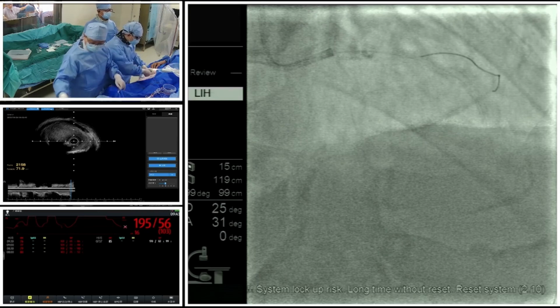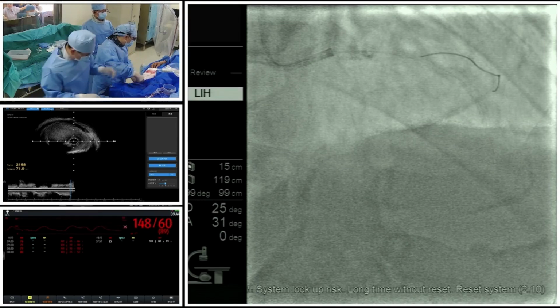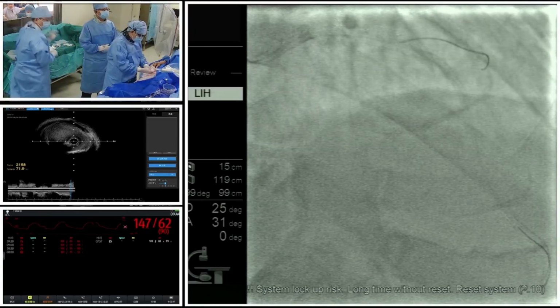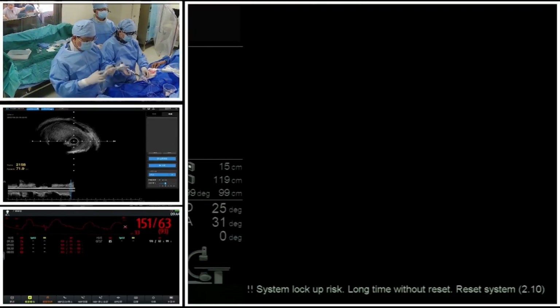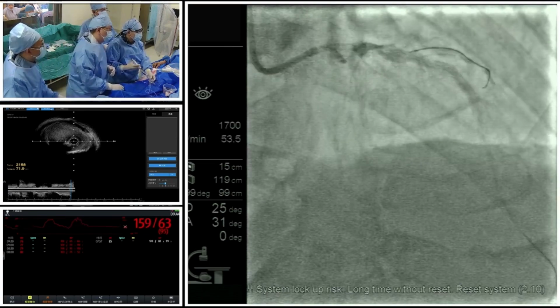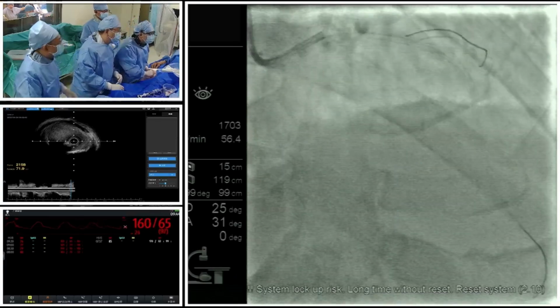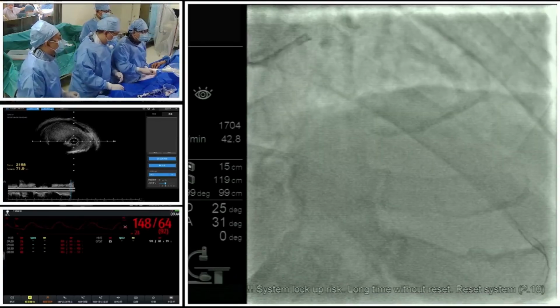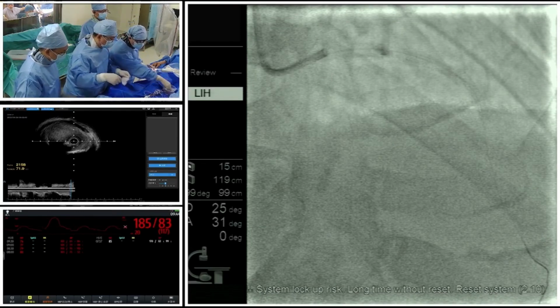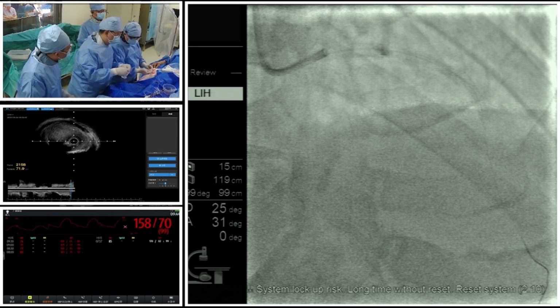Yes, just like Dr. Gong said, we have so many weapons, and in recent years, we have many articles telling us about the methods against calcification. There are some very complex algorithms telling us when we will use rota, when we will use IVL. But I have just read an article this year, published in Cardiovascular Intervention and Therapeutics.